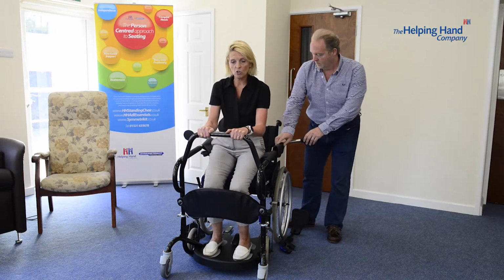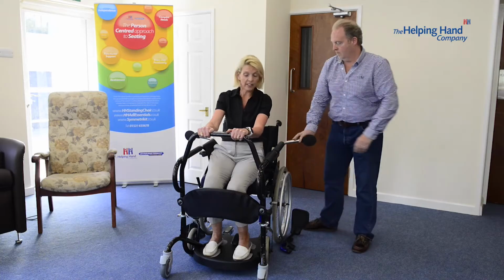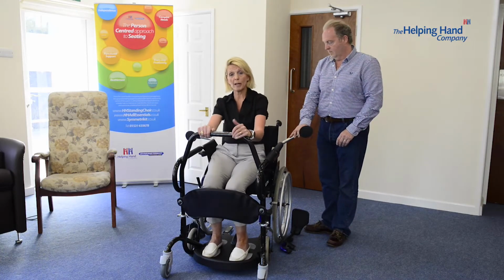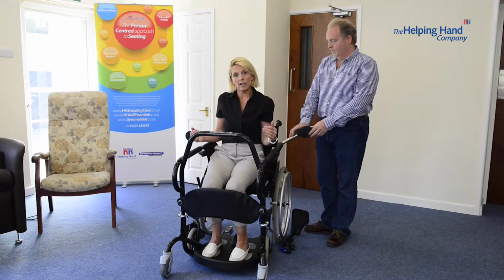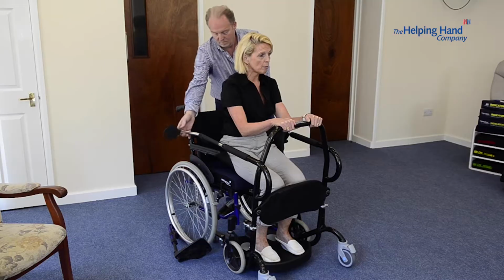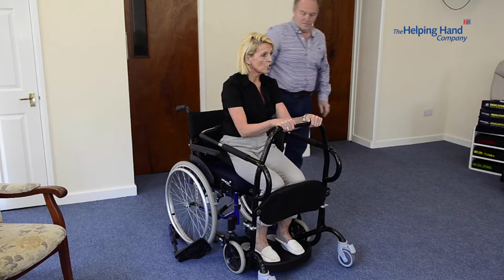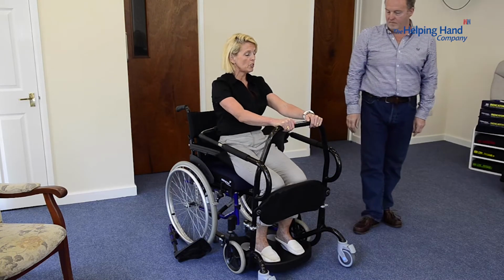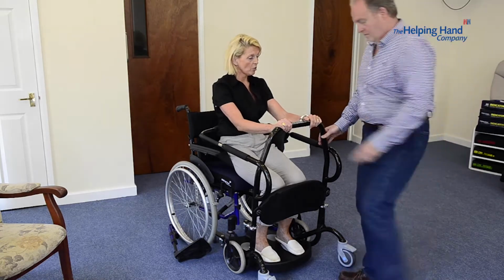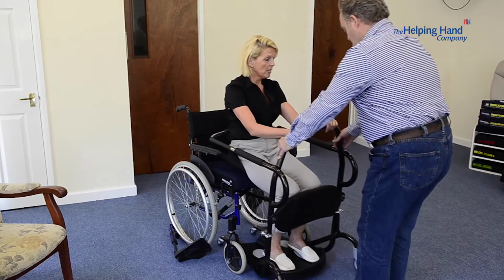And then I sit straight back down, and it feels just like I'm sitting on the wheelchair, but I'm not. I'm actually on the seat, but I still have the reassurance of the wheelchair around me. Again, make sure that we put these back paddles in, just in case you get any involuntary movement. And here I am secured on the cricket, brakes off, and then we pull out.